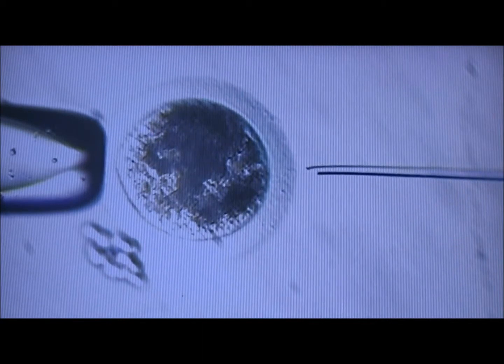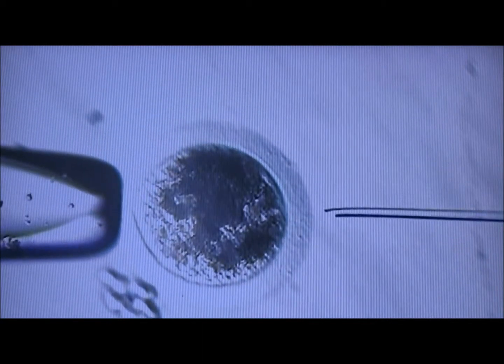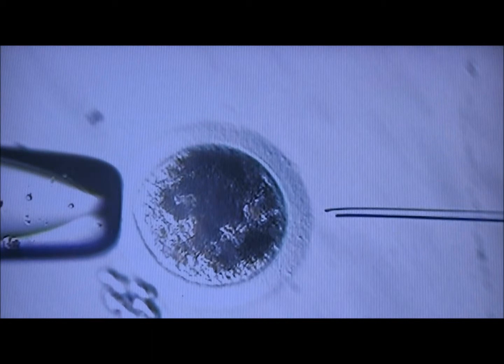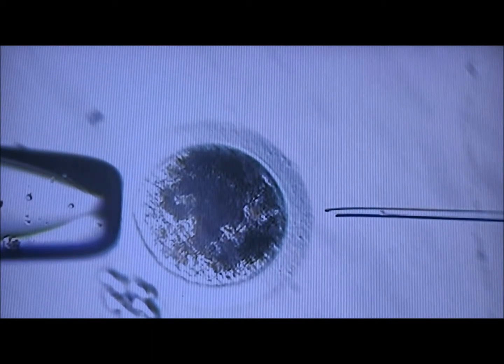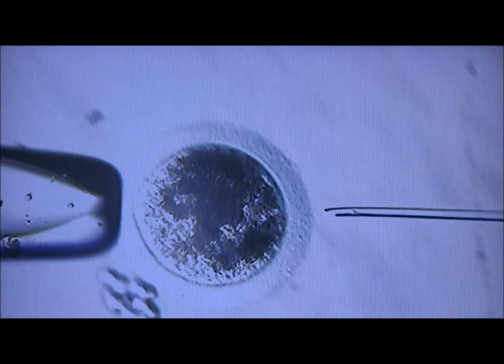Then the sperm is slowly advanced up the injection pipette until it is in position, and fertilization is accomplished by inserting the injection pipette with the sperm through the zona, which is the shell of the egg, and into the inside of the egg.